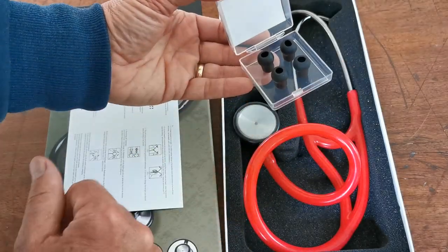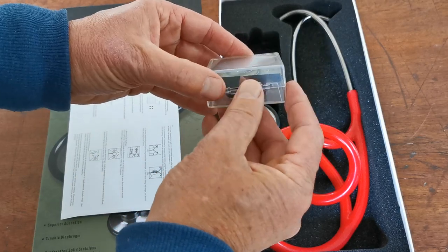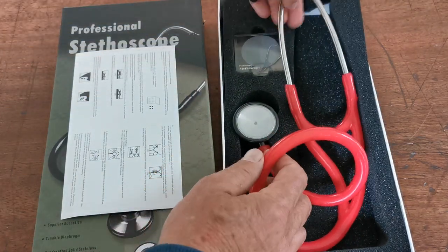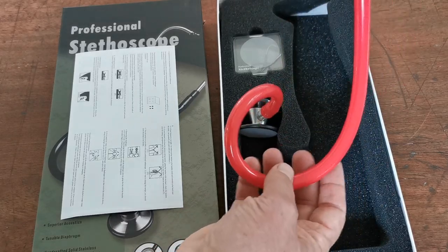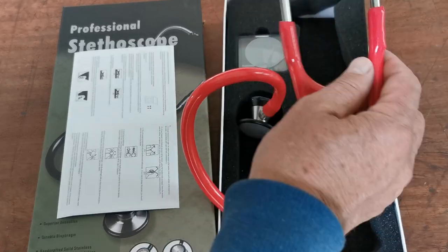Along with two sets of soft replacement ear tips if you need them — they're in that little box. It's a full-size adult piece of kit. The auscultation quality on this is excellent; it's a really nice big lumen tube.